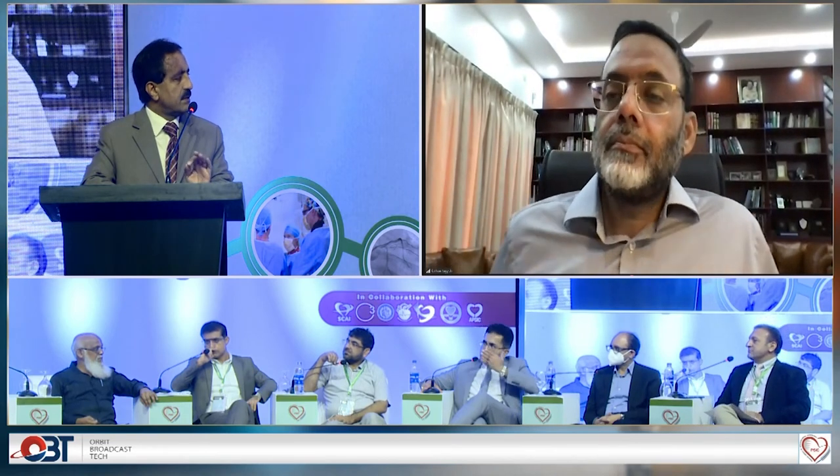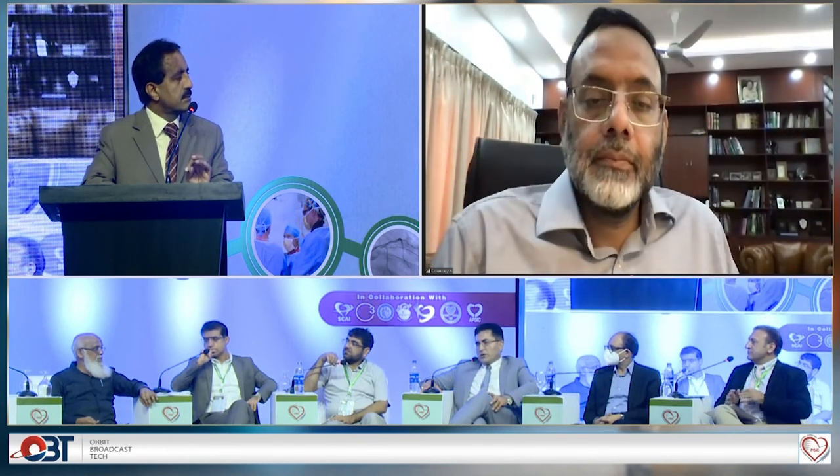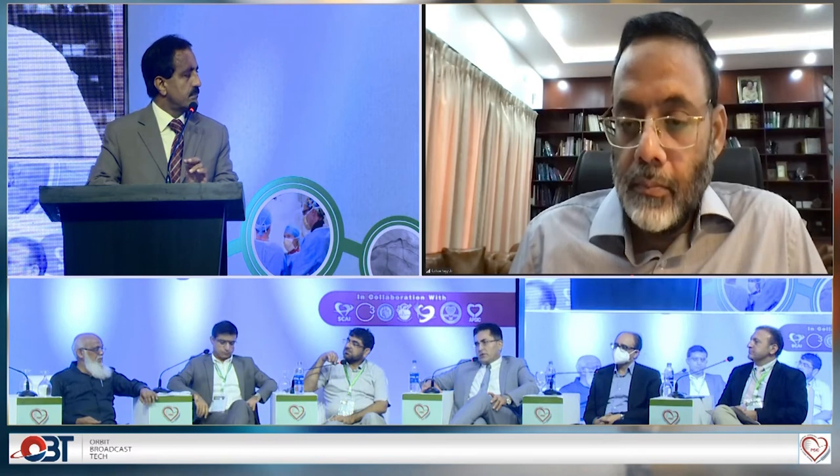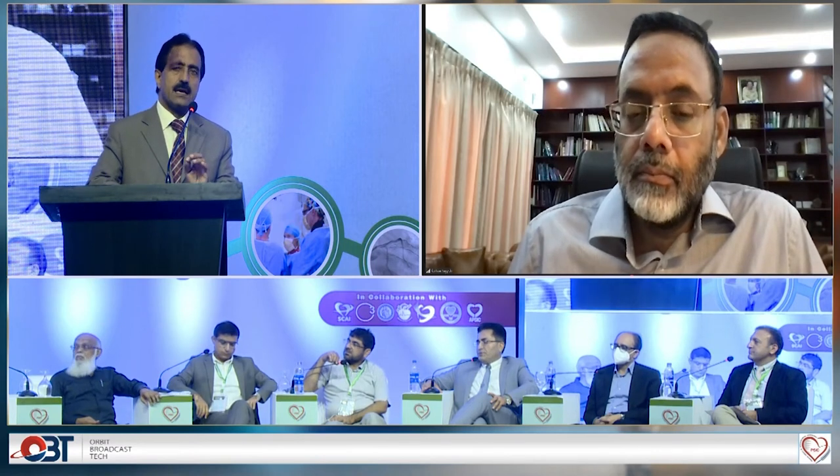I was making the same point as Dr. Bashir said. The left main LAD ostium looked hazy at that point. Left main stenting was an option to avoid such complications, and we could have dealt with the circ provisionally at that point. That's an excellent point.